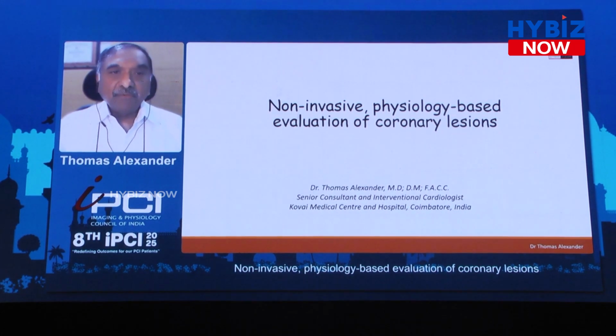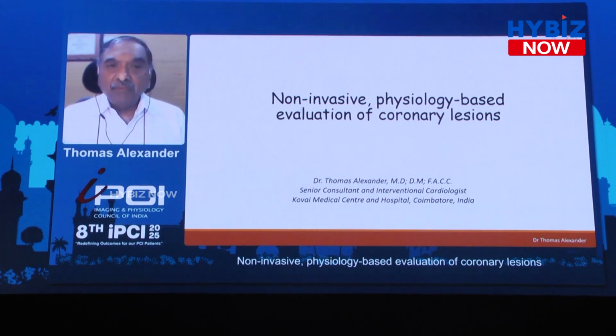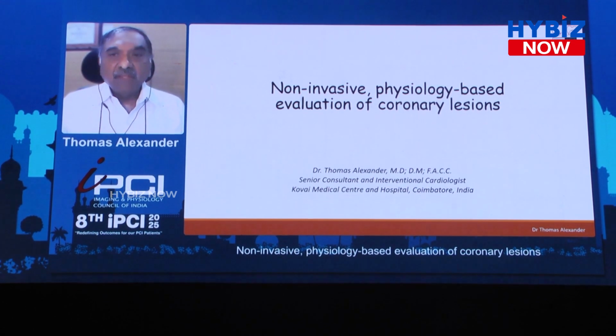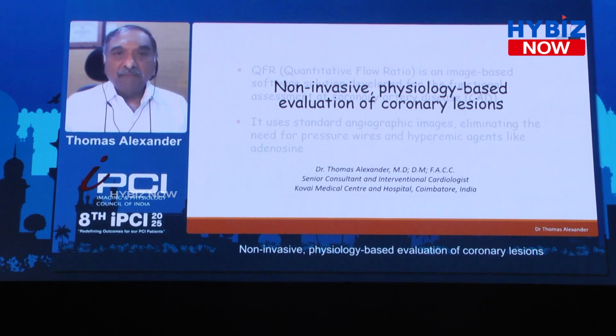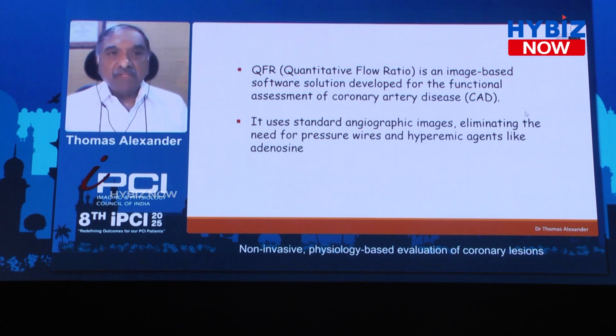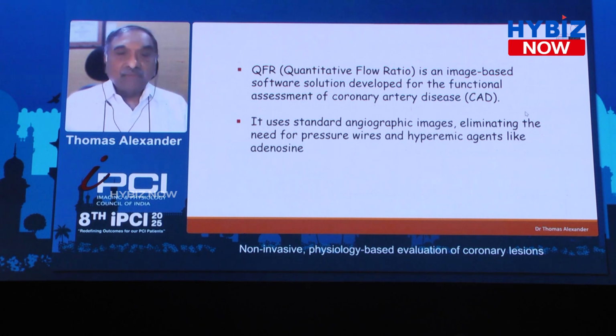Now, I'm going to talk to you over the next 10 minutes on the use of non-invasive physiology-based evaluation of coronary lesion. Primarily, I'm going to talk to you about QFR, which is an image-based software solution developed for the functional assessment of coronary artery disease, primarily lesions. And it uses standard angiographic images and eliminates the need for pressure wires and hyperemic agents.